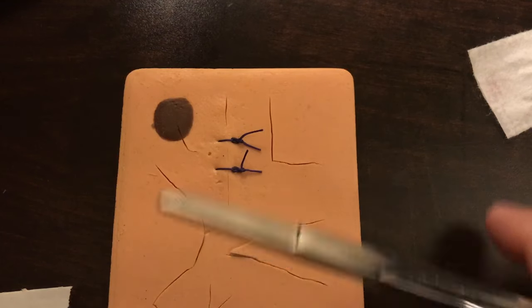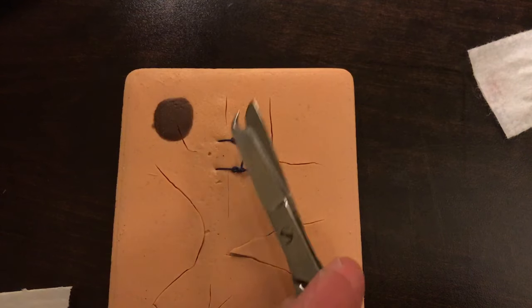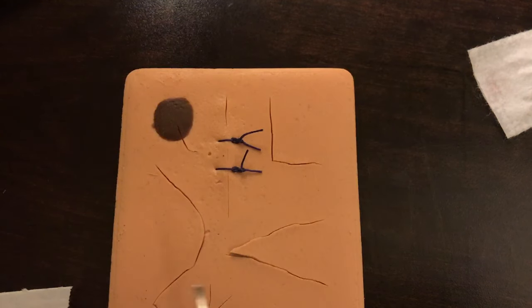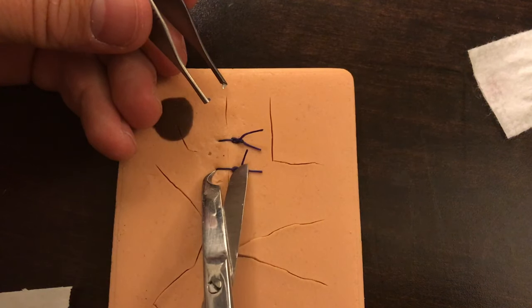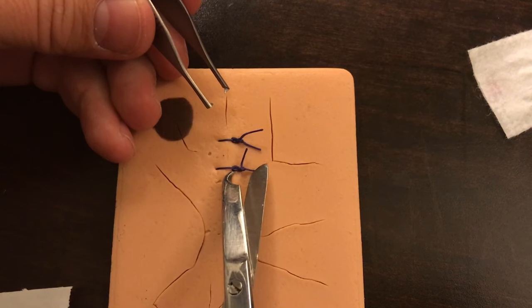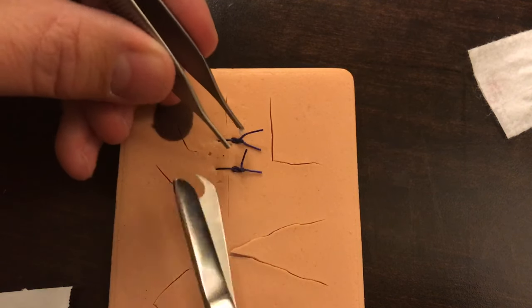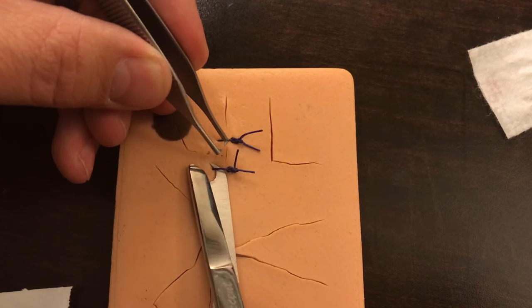Then we're going to take a suture scissor — I like the kind that have the little hook, so it makes it easier to hook underneath. What we're going to try to do is cut either on the far left side right where it enters the skin, or cut right underneath the knot on the other side. There are two different ways to do this.